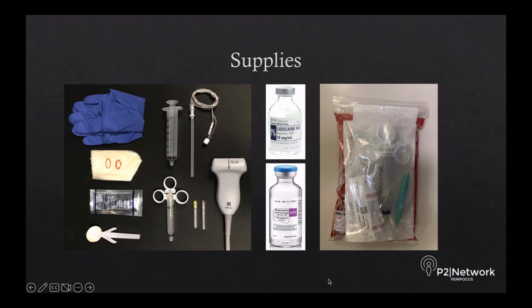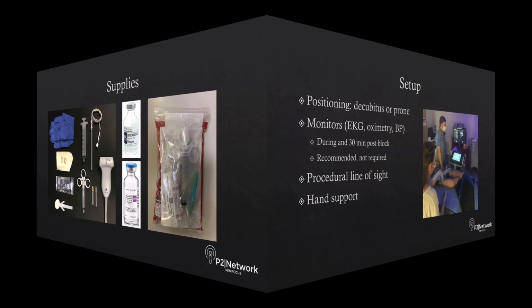One recommendation is to have all these supplies pre-gathered in little block kits shown here. This saves other members of your department time and having to collect supplies for a block, and I find it increases the performance of blocks.